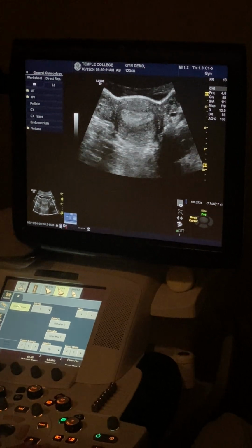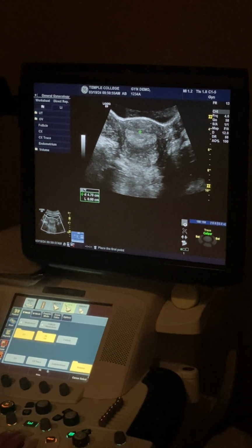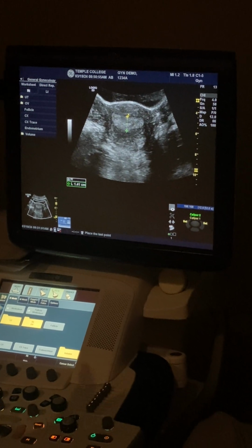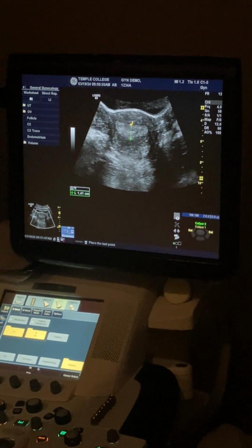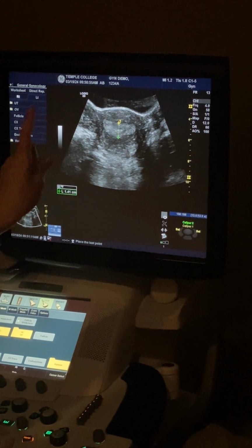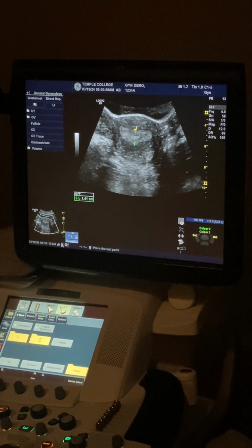When you're doing it trans, the trick is just to get it even. Does that make sense? About like that, right? Let's see what we measure here. Little less, not too far off, but comparable. So, if you cannot see it in the long as well as you can with her, try the trans, but do you see how clear the borders are and how it's even across for the most part? That's what your criteria is when you do a transverse endometrium.